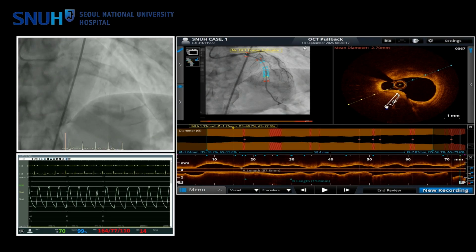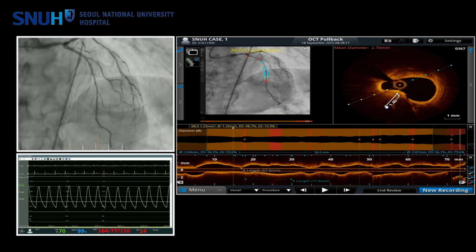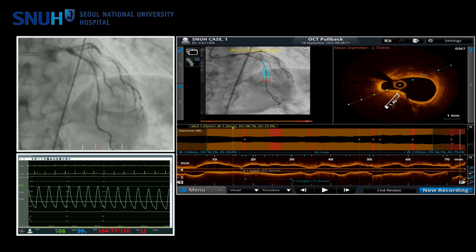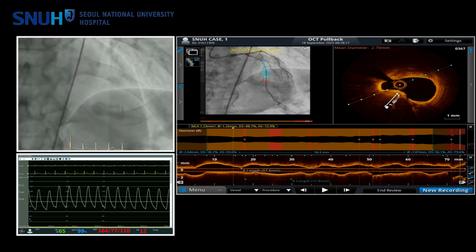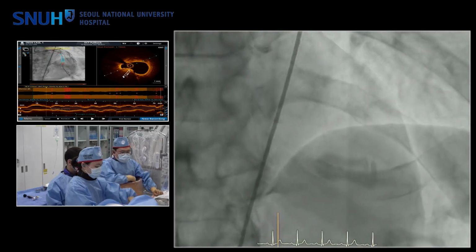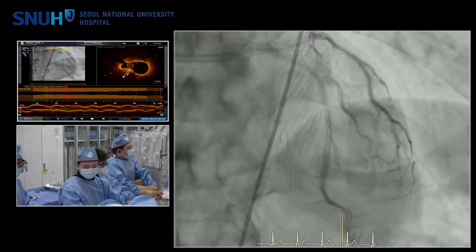Okay, please ask questions and discuss. Yeah. Then we are going to do the procedure. Okay, go ahead. This is already 12 minutes passed since we started.